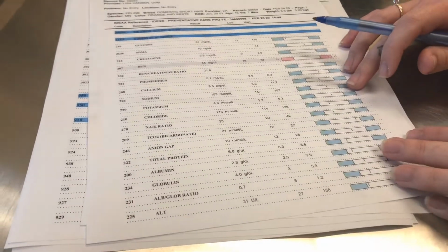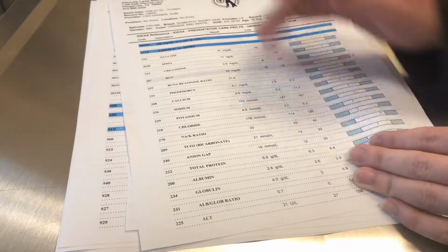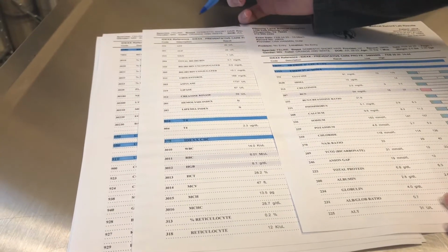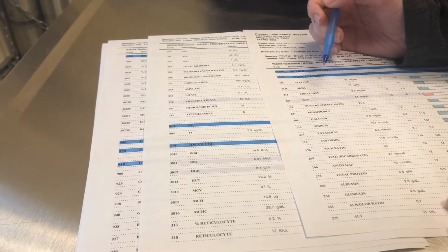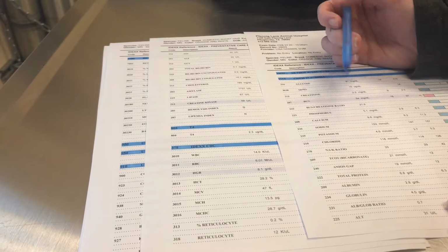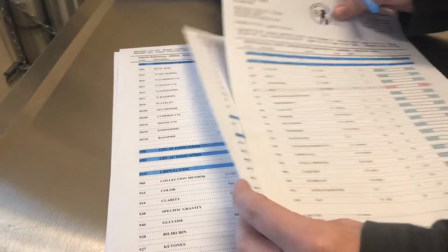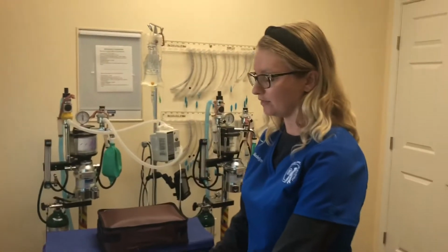They also require chemistries. So an example is here. This evaluates liver, so that would be ALT, ALP, over here as well. Kidney values such as BUN and creatinine, and electrolytes such as sodium, potassium, chloride. Those evaluate internal organ functions. Those are also the organs that metabolize anesthesia, so it's important to know that they are functioning well.